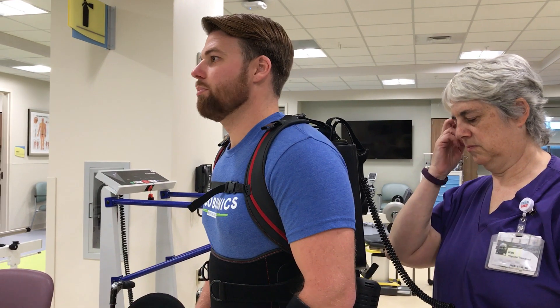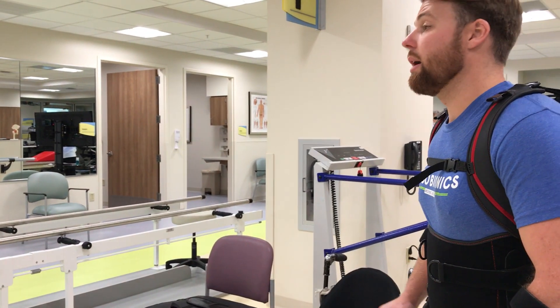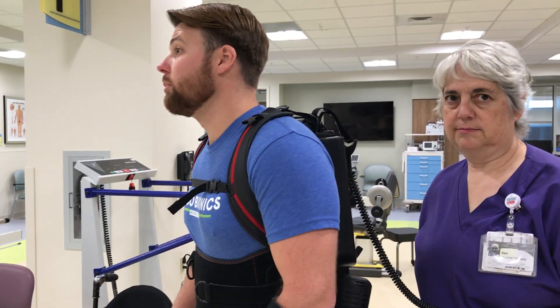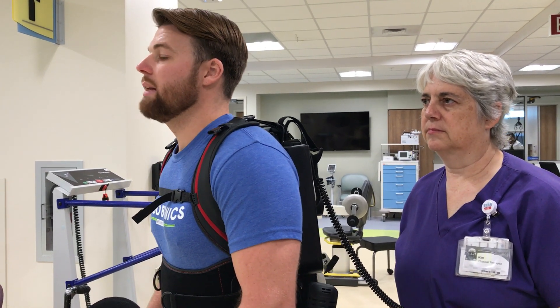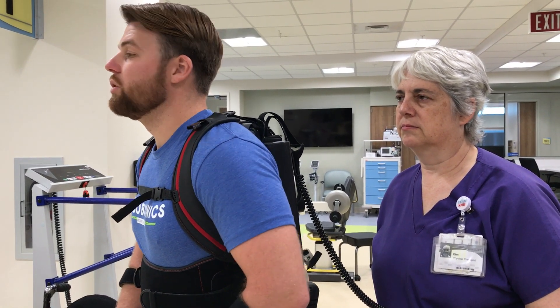It's pretty tough on your upper body and takes a lot of strength. In this device, I don't have to worry about fatiguing my upper body — I can work on isolating all the muscles I have and work on every aspect: the hip flexion, the quads, the hamstrings. It's not just straight leg braces only using my hip flexion.